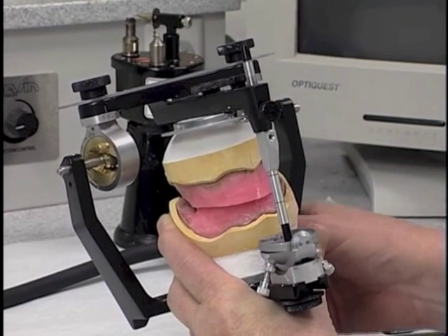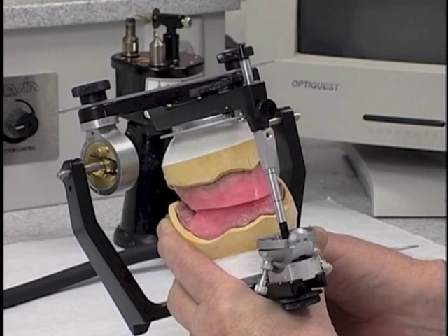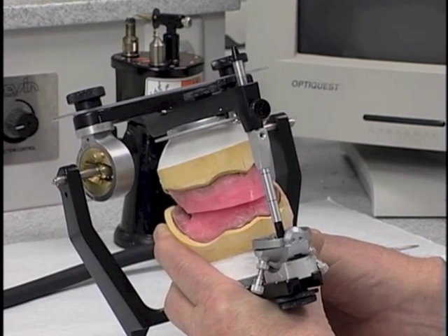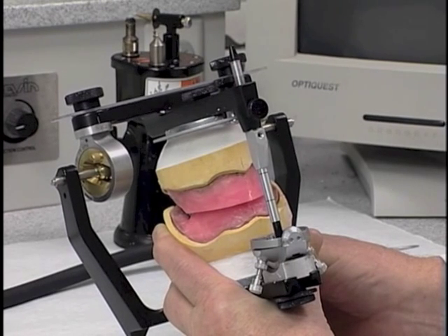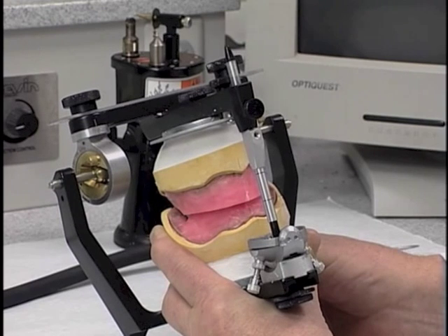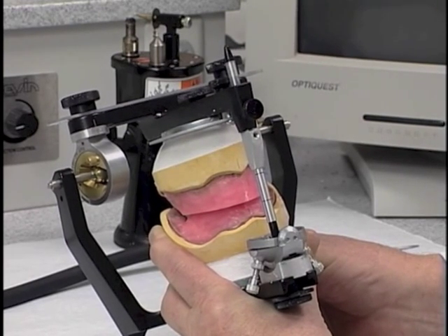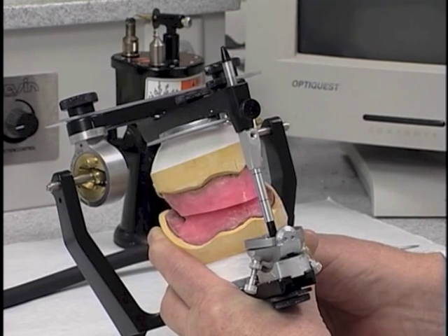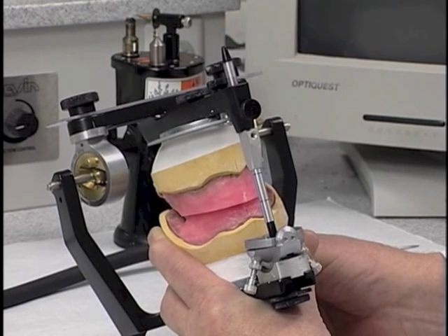In the arrangement of anterior teeth for a full anatomical cross-arch balanced occlusion, the patient can tolerate a lot more vertical overlap of the anterior teeth than they can if we were using non-anatomical teeth or even lingualized occlusion. So what generally we do in arranging teeth for the full anatomical occlusion is we will arrange the 6 maxillary anterior teeth to what we think is a nice aesthetic arrangement.